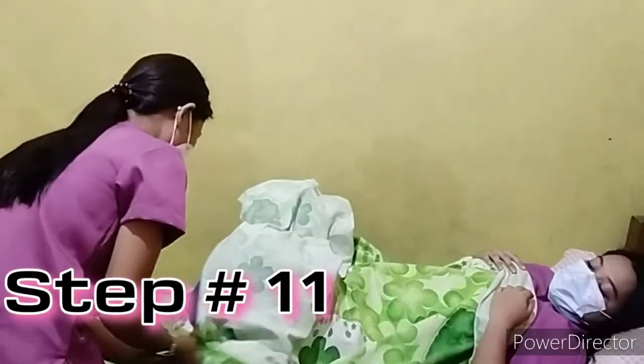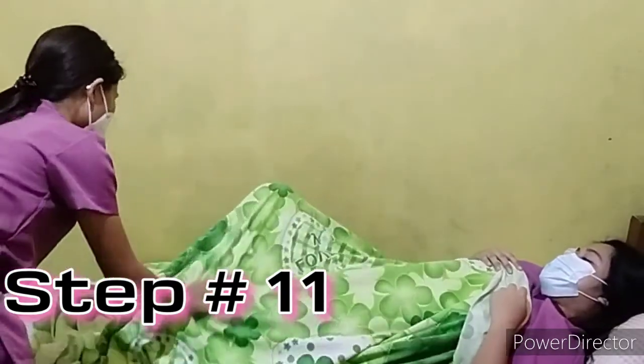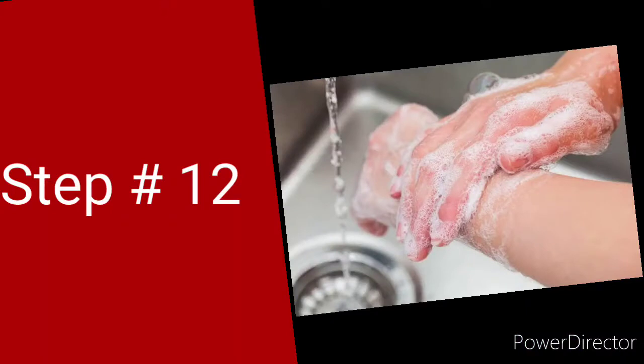11. Reposition the patient for comfort and apply a vaginal pad. It is to promote relaxation and rest for the patient. Lastly, return equipment to the proper storage area to maintain order and safety. And last, don't forget to wash your hands to prevent the spread of microorganisms.